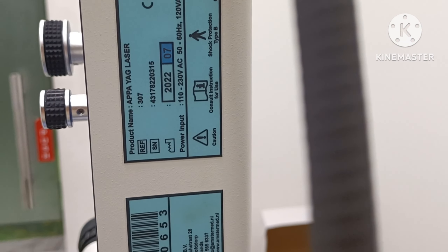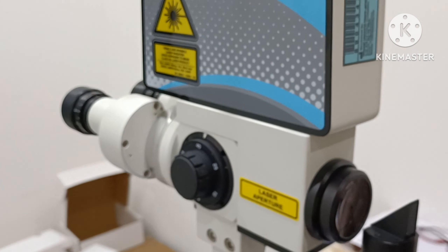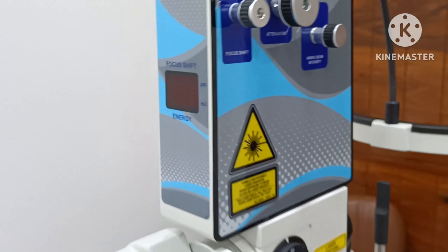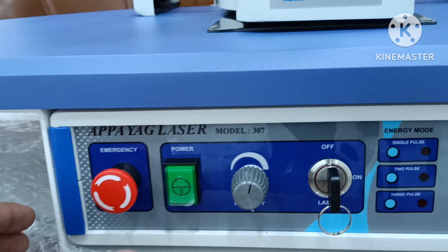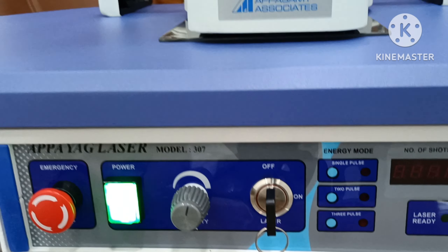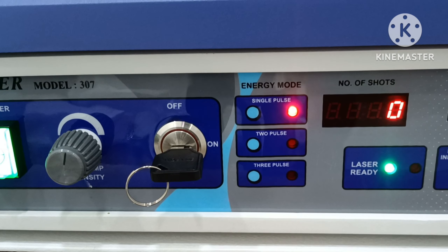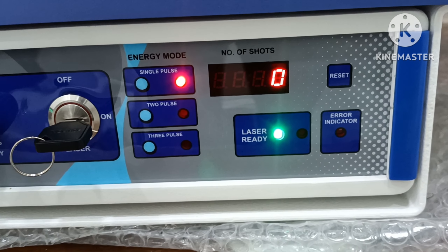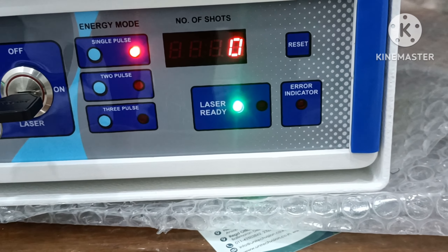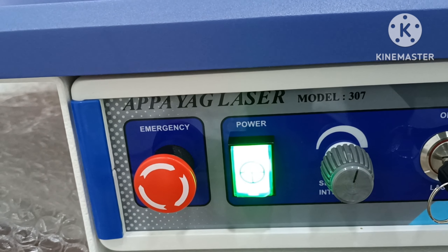Product name. Here is power button, and YAG laser on. Energy mode: single pulse, 2 pulse, 3 pulse, number of shots, laser ready, error indicator available, emergency switch.